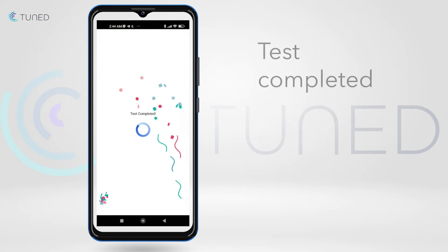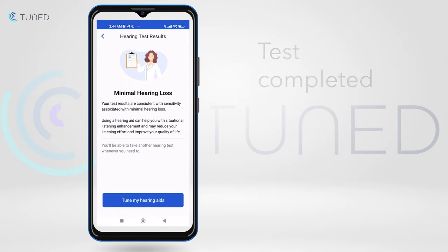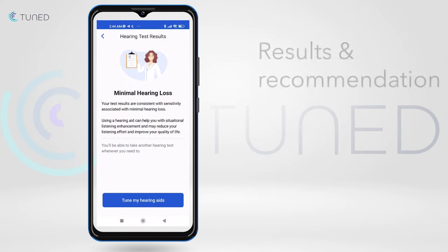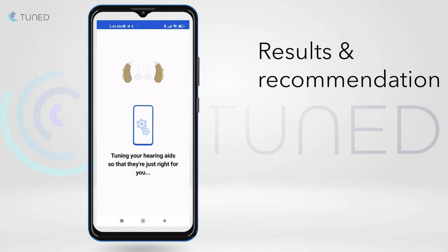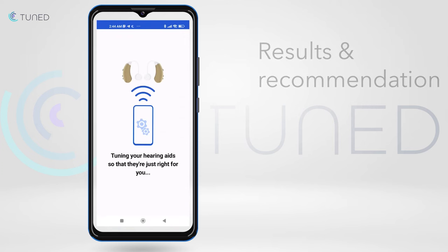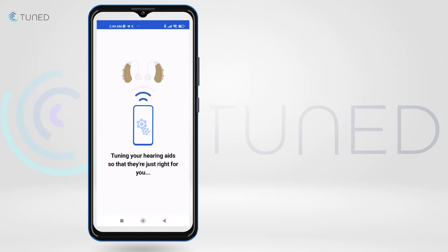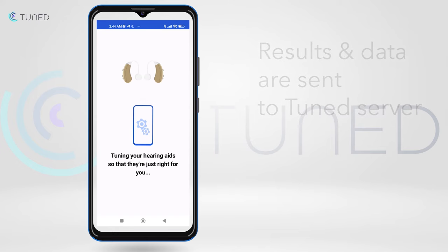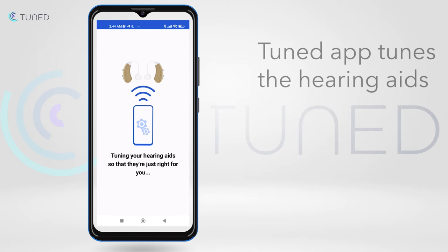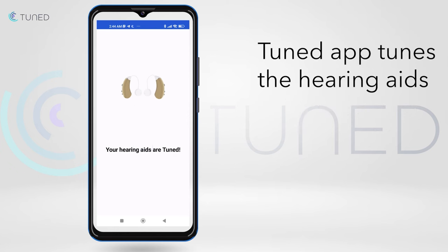When the test is completed, the user will get a short brief of the results and a recommendation to start using the hearing aids. Once the Tune My Hearing Aids button is pressed, the hearing test results and other data are sent to the server, where a unique algorithm tunes the hearing aids according to the specific user's needs.